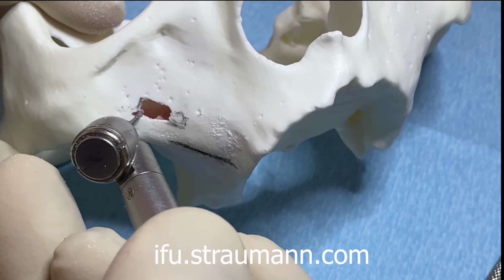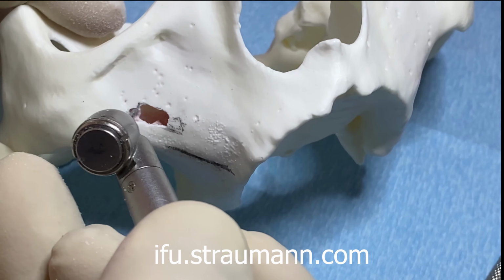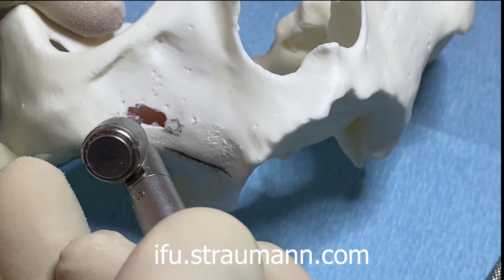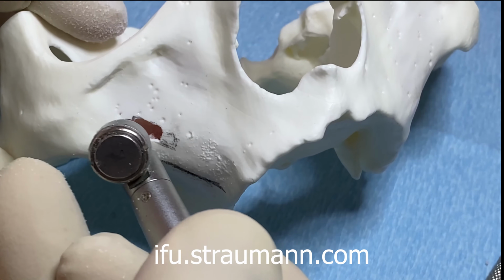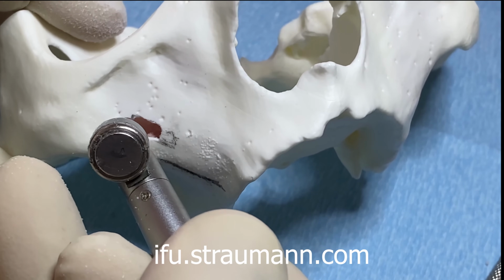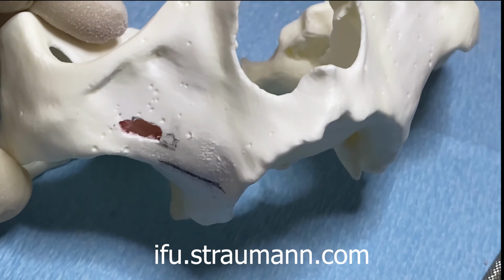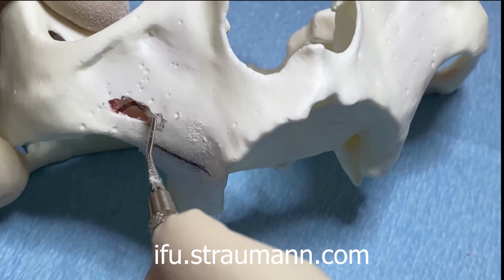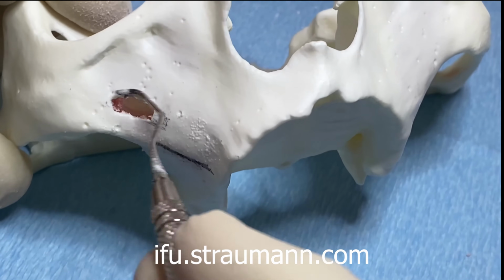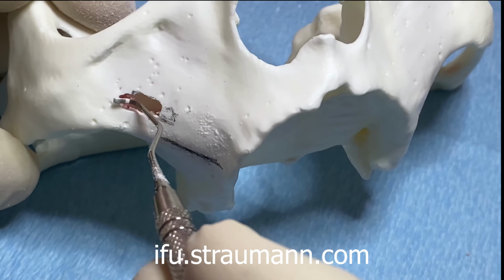And it's much better to go incrementally, go a little bit at a time. So a couple of more millimeters up. And we can check again, and see if we can actually see the roof. And the roof is right here right now. So I'm quite comfortable. I'm about a millimeter or two.